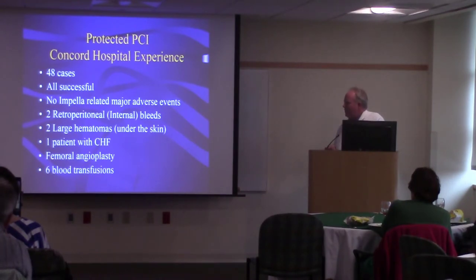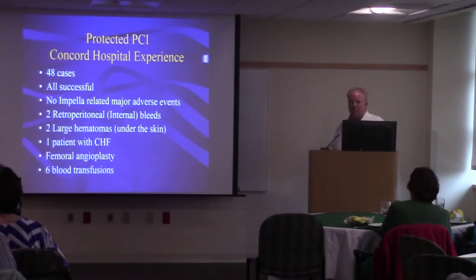We have had a couple patients with internal bleeding that was self-limited. We didn't have to go in and surgically correct it. We were able to treat it just with medications. We have 2 hematomas, so bleeding under the skin. The device we use is fairly big, and sometimes there's a little bleeding around the device, or when we take the device out, there's some bleeding under the skin, but again, that tends not to be a major complication.